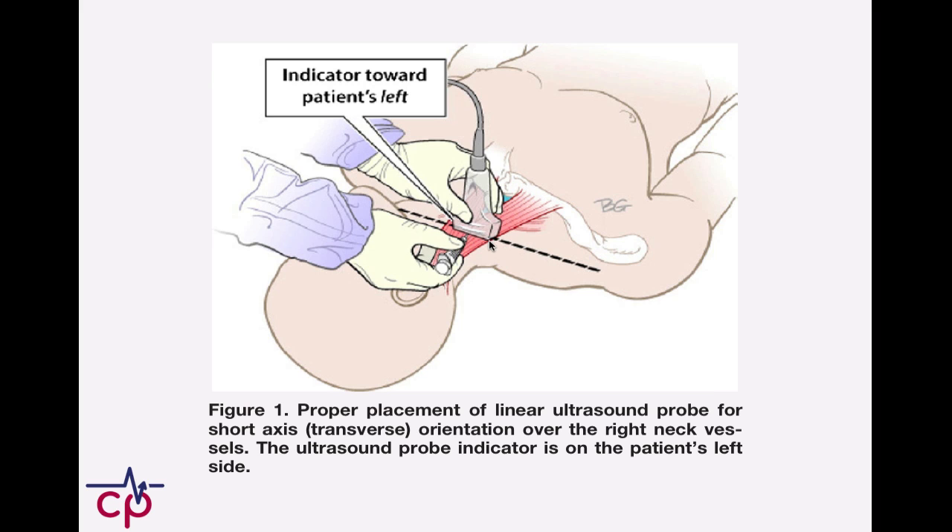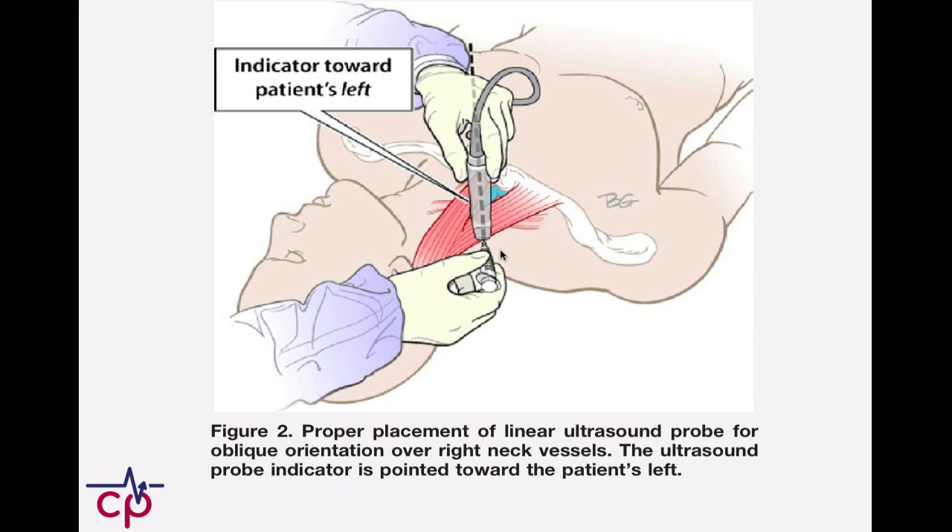Just to review: the standard transverse technique has the needle going perpendicular to the probe, giving a transverse orientation view of the vessels. The oblique approach just has us rotate 45 degrees, but in this case the needle is going in the plane of the probe.